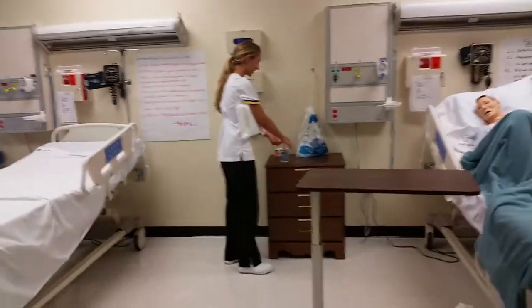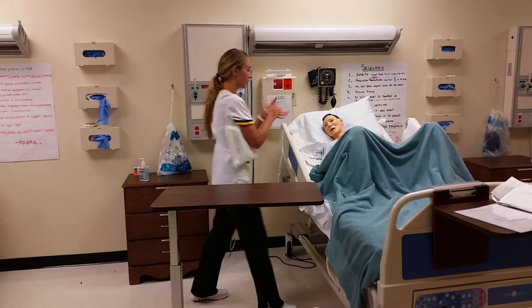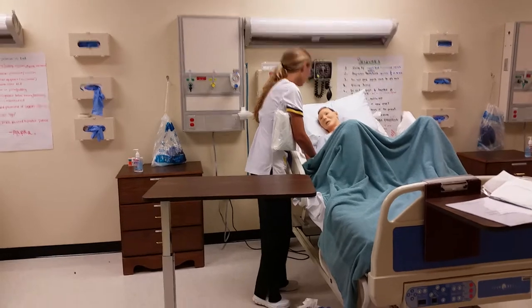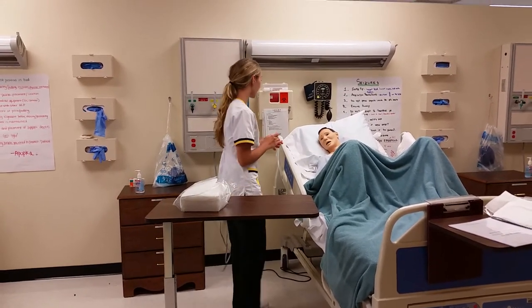I'm going to perform my hand hygiene. Hi, I'm Allie. I'm going to be your student nurse today. Can you tell me your name and date of birth? Charlene Knight, 8839. And can you tell me about your allergies? Latex, penicillin, and betadine. Okay, great.